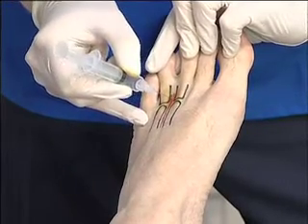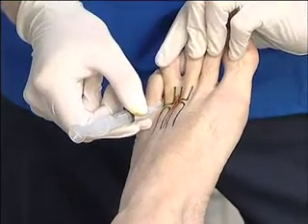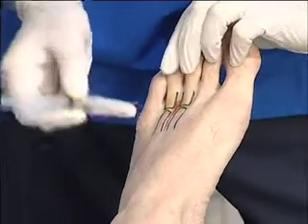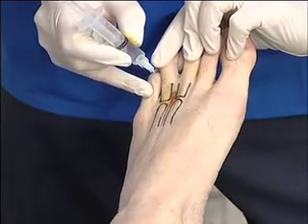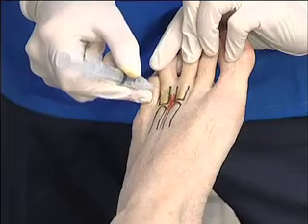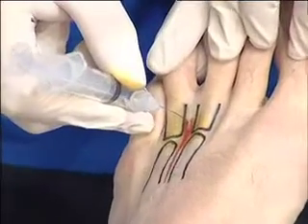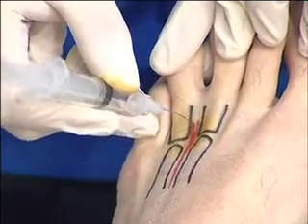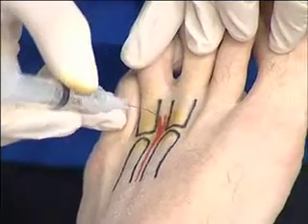You're looking for the patient to give you feedback as to when you're on the right spot. I'm just a little bit proximal there, so I'm going to come out and come in a little bit more distally — scratch again, ligament just there, and I'm pushing on through. You really do need to take your time to locate the nerve, as it is quite deep down.